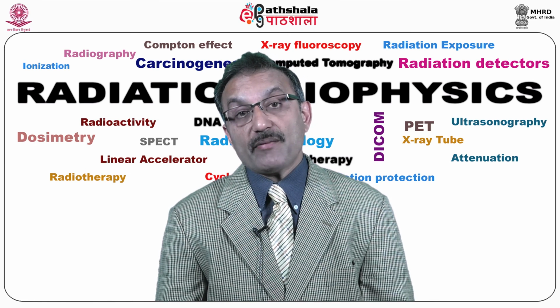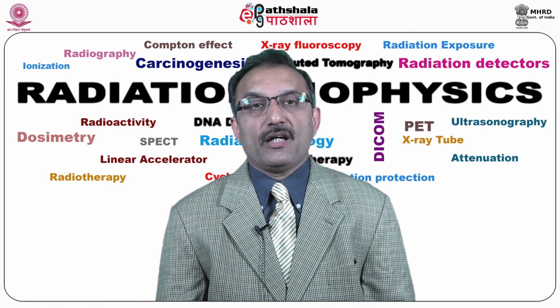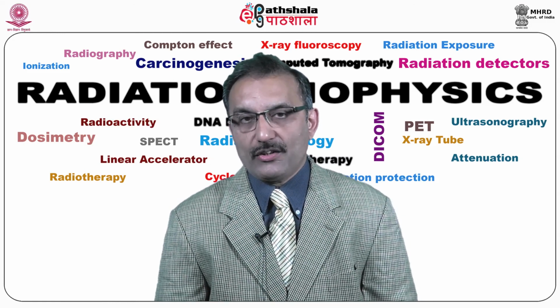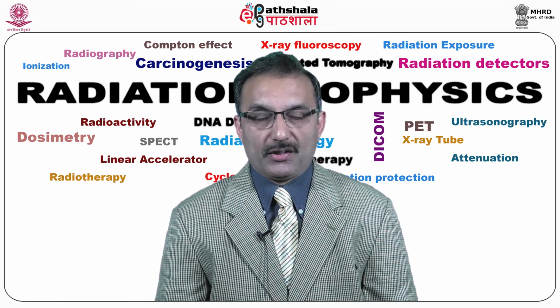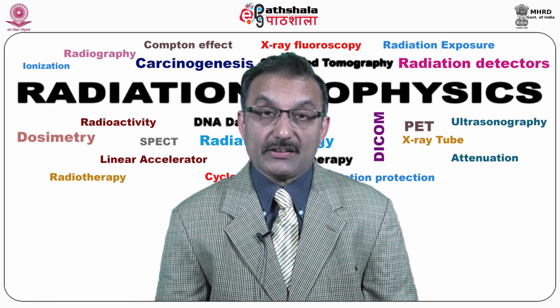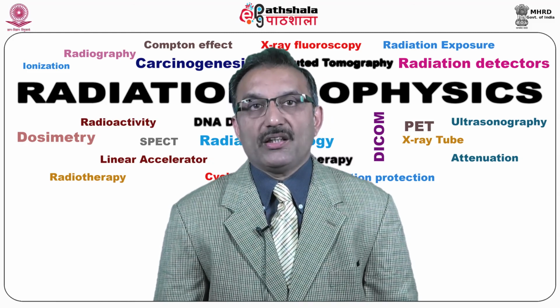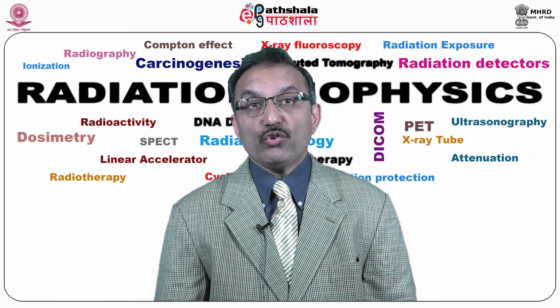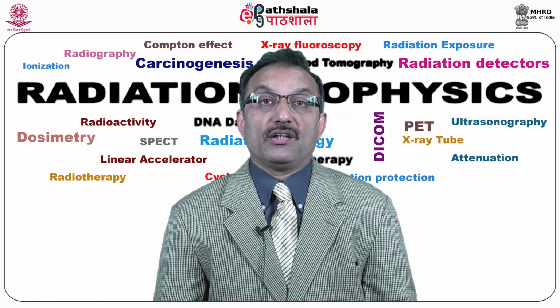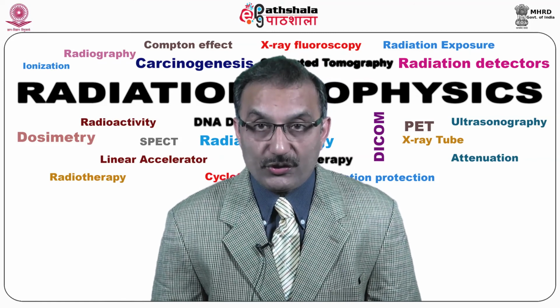Similarly, if contamination has already taken place at some point, whether on the detector or on the couch, and when you take the image you find a hot spot there, you might say that the patient has some problem. But it is not the patient's disease; it is a contamination problem, a problem in the couch or maybe some detector. So we have to look into what disadvantages there can be because of contamination problems or because of some kind of QA problems, which is one of the most important things we have to see to.